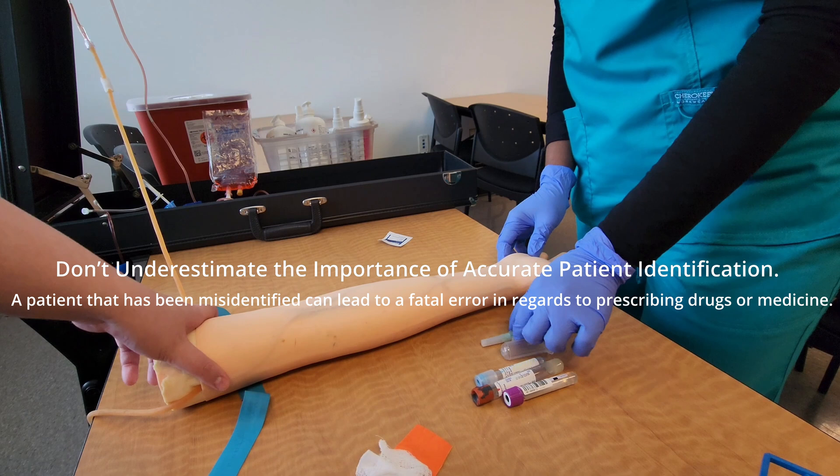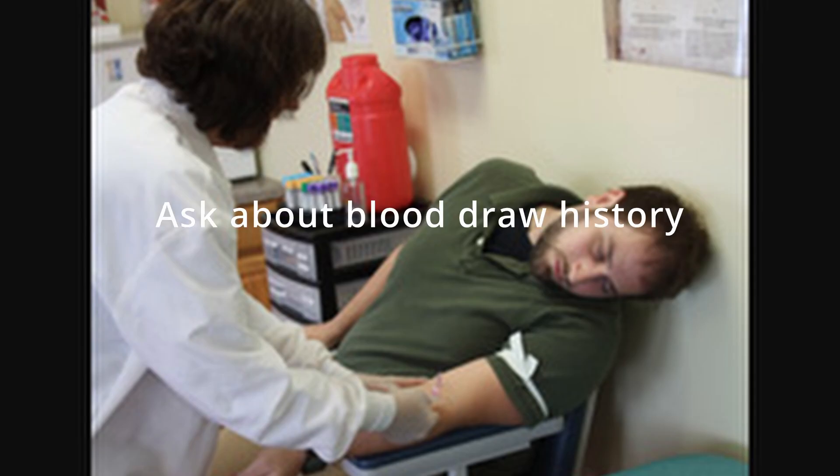Once they agree, the next thing is to ask for their full name and date of birth. You can also confirm by asking them to spell either their first or last name. This is because some patients have similar names or similar pronunciation, and you want to make sure you have the right person. The next question to ask the patient is about their blood draw history.